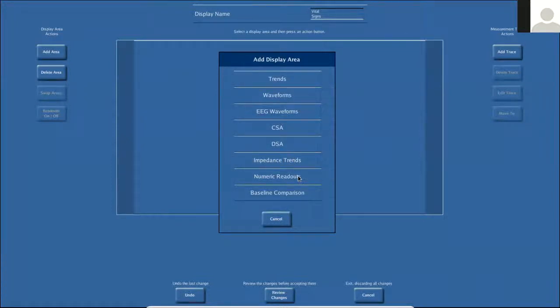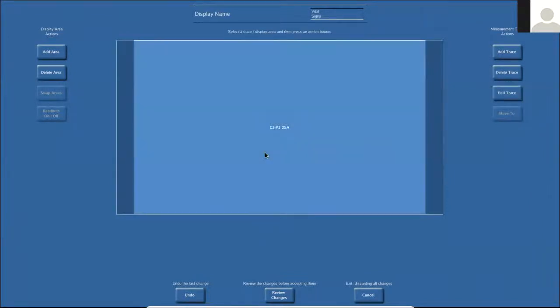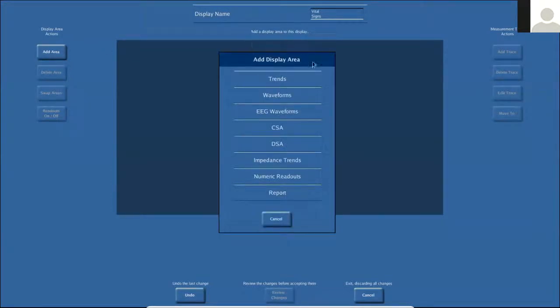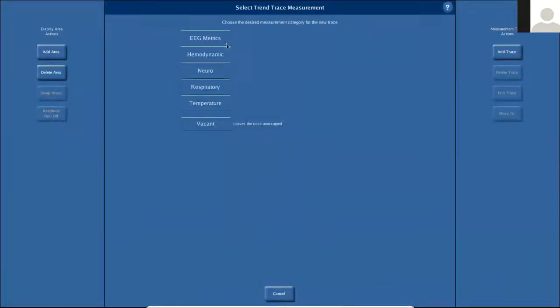Sorry to interrupt you. It looked like you just deleted all your trends, and so I just thought it was a good opportunity to let people know that right now you have just the DSA and you got rid of all those other things, but you could undo that or review and go back to whatever was the last saved protocol. So if someone is like, oh my gosh, I just got rid of everything I used to have. Yep, you definitely could undo that.